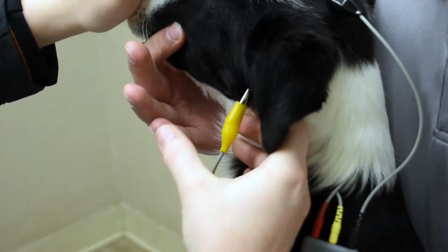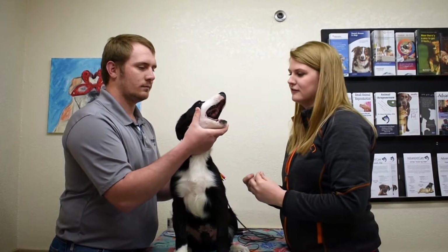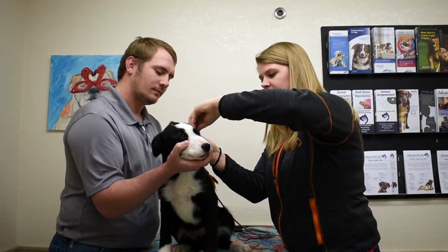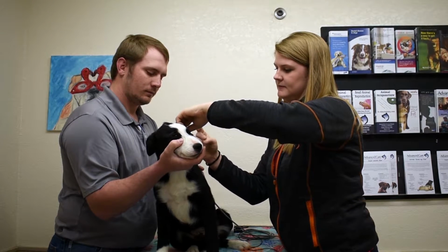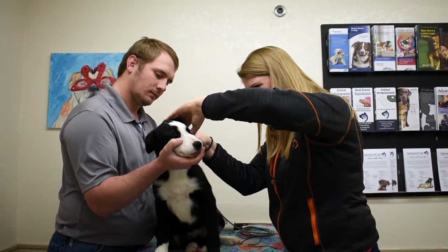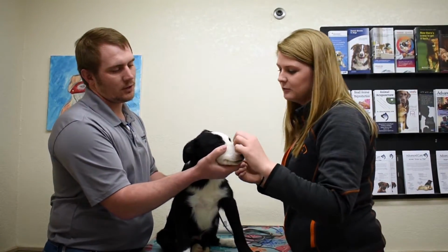Hey buddy, good baby, good boy. Sometimes these puppies are really good for sitting still, and sometimes they get a little impatient, so we'll see. He's a pretty good boy, so I figure he'd be a good first-timer here. I'd say the hardest job sometimes is just getting these leads placed. If you have any breeds with coat, sometimes it takes a little bit of time to get things situated. Good.